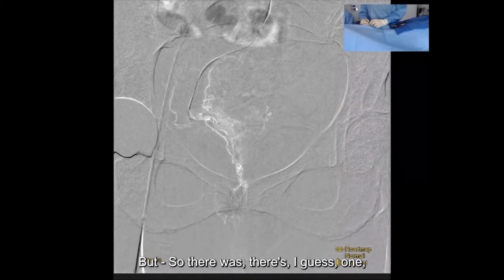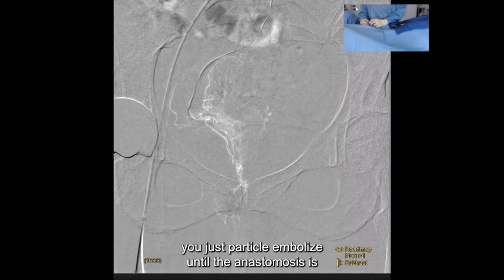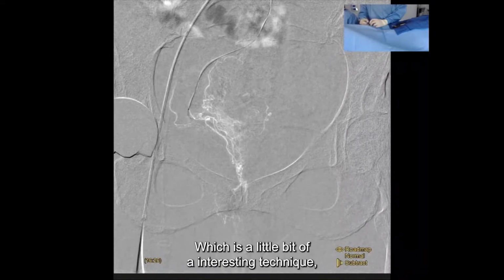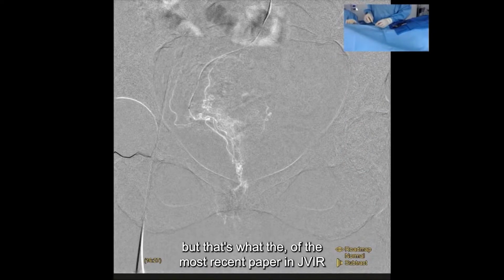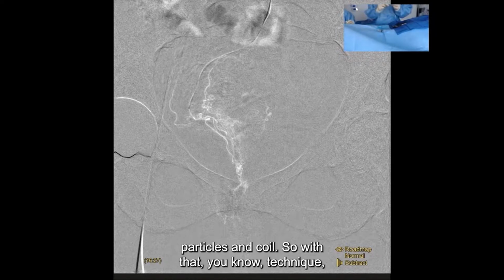But there's, I guess, one of the papers that talks about if you see the anastomosis like this, you just particle embolize until the anastomosis is no longer visible, which is a little bit of an interesting technique, but that's what the most recent paper in JVIR described. Yeah, I tend to use both, as you know, particles and coils.